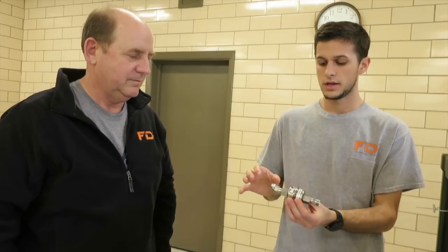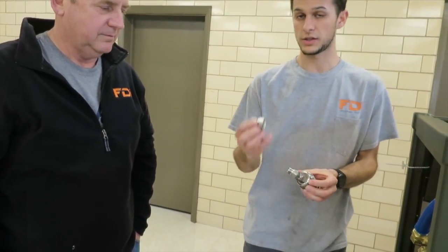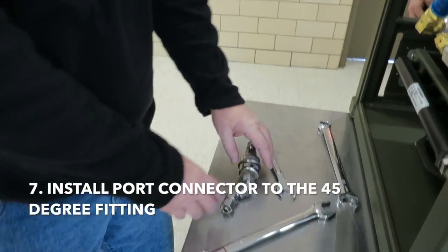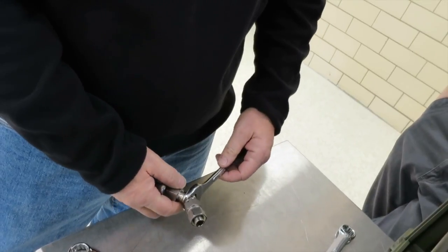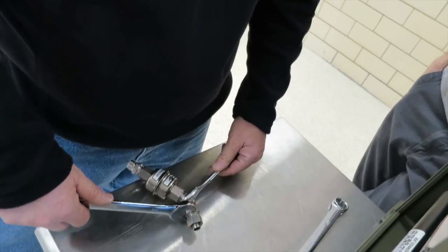Alright, so the replacement part you'll get for a steam trap will already have the fittings pre-installed. That way you don't have to mess with the MPT, and all you have to do is the tube fittings for the Swagelok. So that's why we're going to reuse this port connector right here. The first step, we're following the steps in reverse order from the manual. He's going to install the port connector to the 45 on the top. So you're going to go finger tight, and you're going to do a final quarter turn, making sure to counter torque.